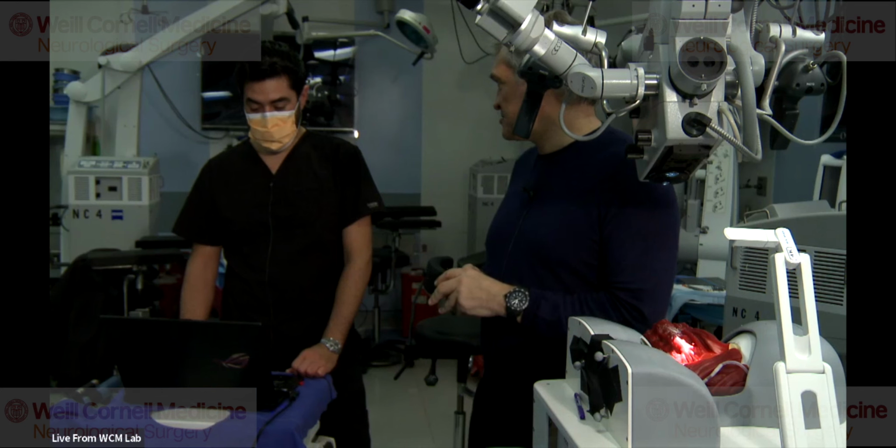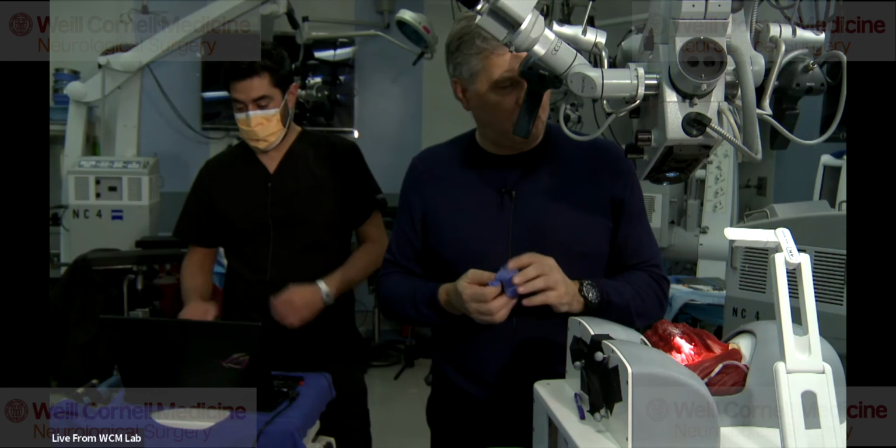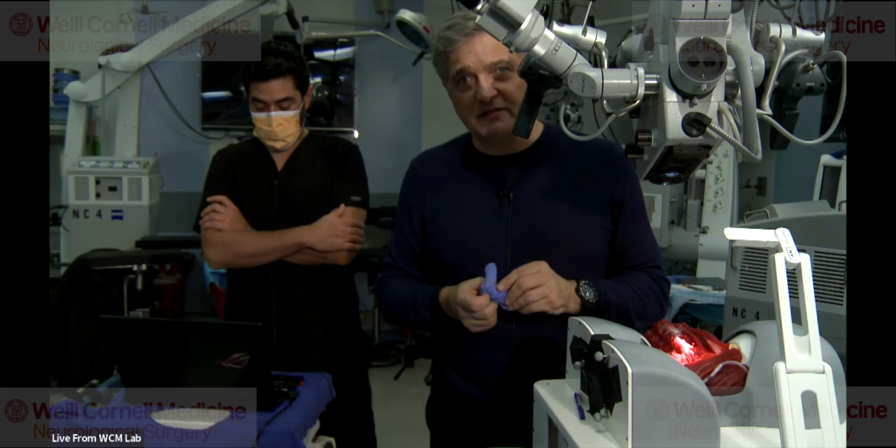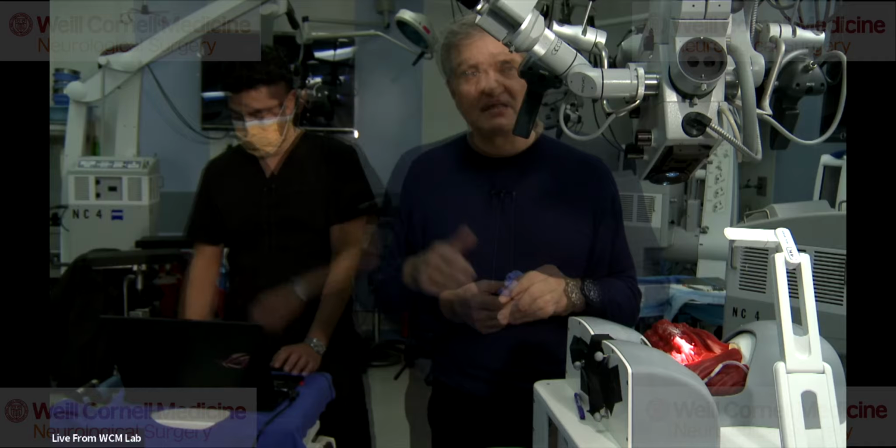I think that's it. We can go there. It's a short operation. That's how it is. It's not a big operation, that's the whole point. It's supposed to be short, sweet, effective. The patient can go home the same day. And thank you.